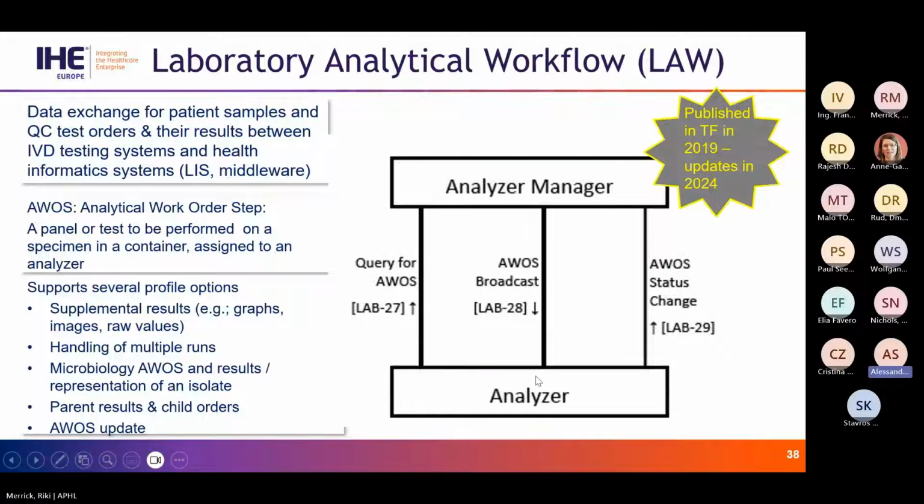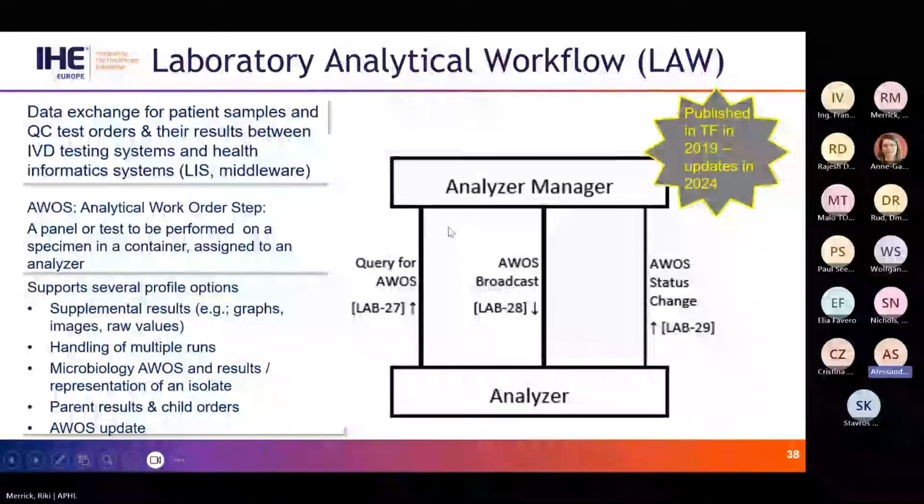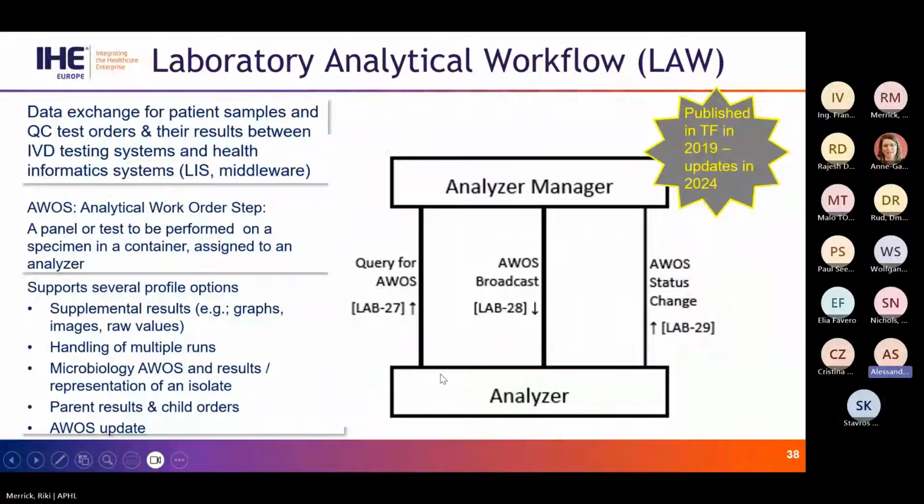that will be performed by the analyzer actor in one or more analyzers. And the way the analyzer manager and analyzer communicate is different according to the modality of transmission of these analytical work order steps. We can have a query for a work order step made by the analyzer to the analyzer manager. For example, when the analyzer receives the specimen and queries the analyzer manager about how many tests it has to do for this specimen.